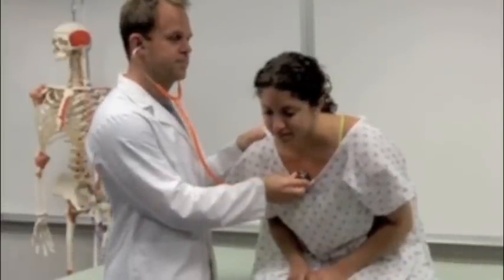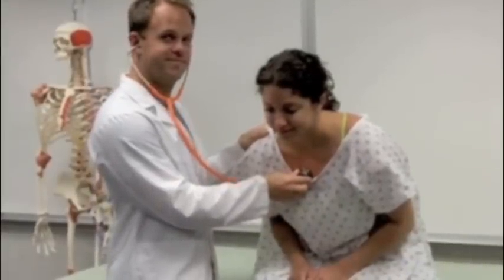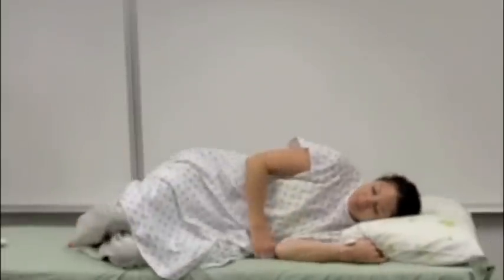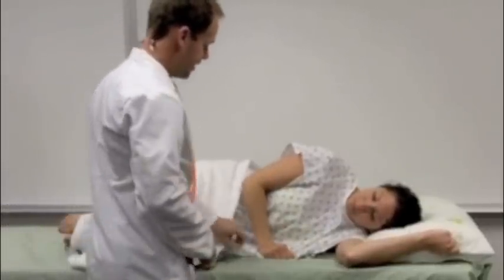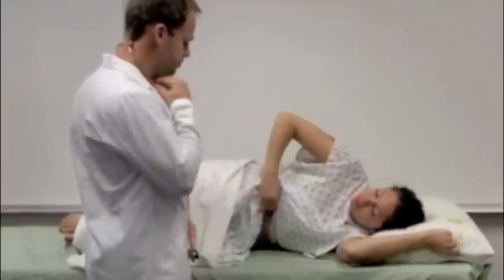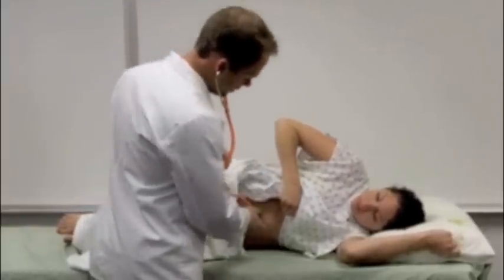Leaning forward for the pulmonic valve. And lying on her left side to access the apex of her heart. Notice the draping. Remember to ask patient assistance when lifting the gown and breast tissue out of the way.